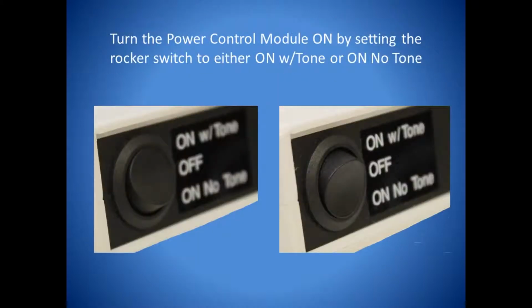Turn the power control module on by setting the rocker switch to either on with tone or on no tone. When you set the rocker switch to on with tone, you will hear a beep from the power control module each time the proximity sensor is activated. When you set the rocker switch to on no tone, you will not hear a beep from the power control module.